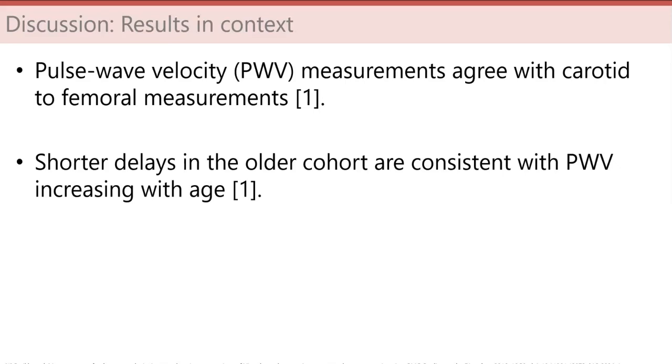So really, as I mentioned before, we've got this new measurement of MRI. Instead of looking at systemic pulse wave velocity, we're starting to look at cerebrovascular health and how the pulse wave goes into the brain, with an emphasis on arterial stiffness. Comparing to the previous literature outside of the brain, we've got this measure where we're getting values that are of the right order. But as I said, there's a lot of variability in our measurements at the moment, and we're working on some different analysis techniques and acquisition techniques to really improve this and get the sensitivity to a level where this can be a useful tool.